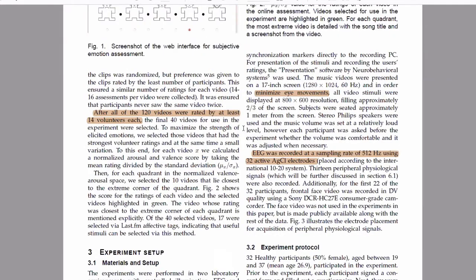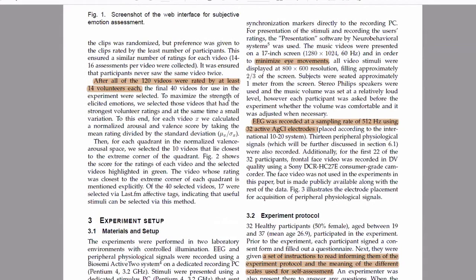During the experiments, in order to minimize the noise, as I think most of you already know, when we collect EEG or EMG data or even ECG data, we get a lot of noise from muscle movement, skin movement. I think all of you have already learned that from the stage 1 study.